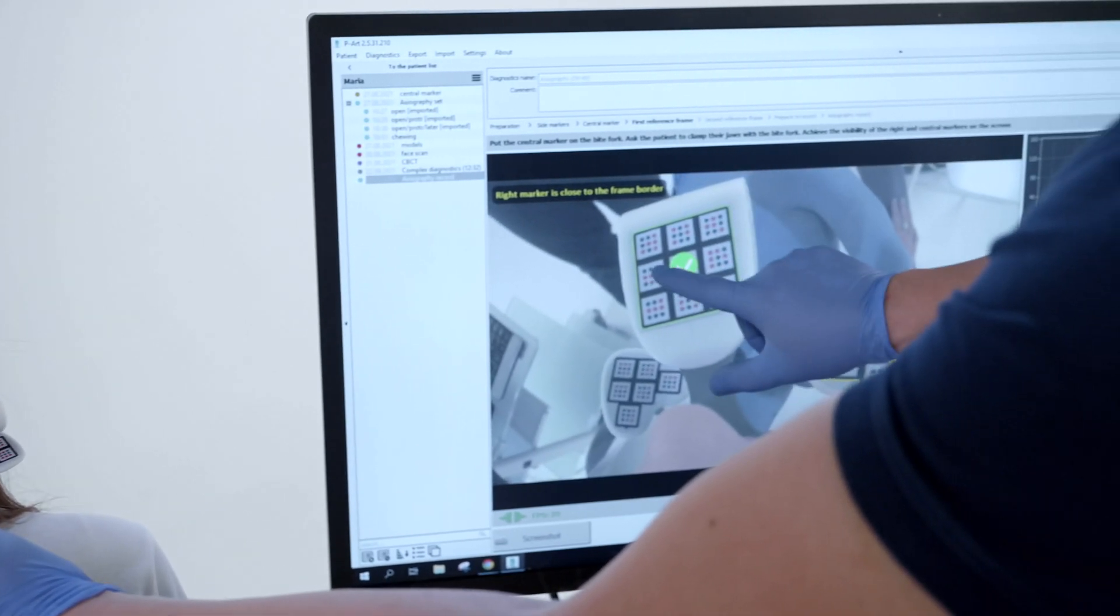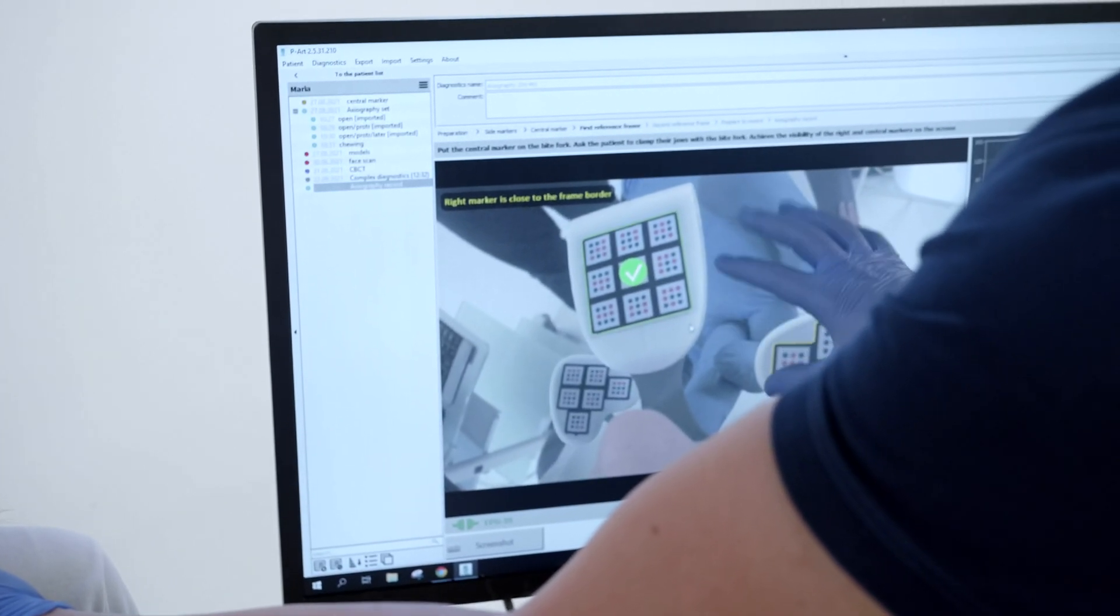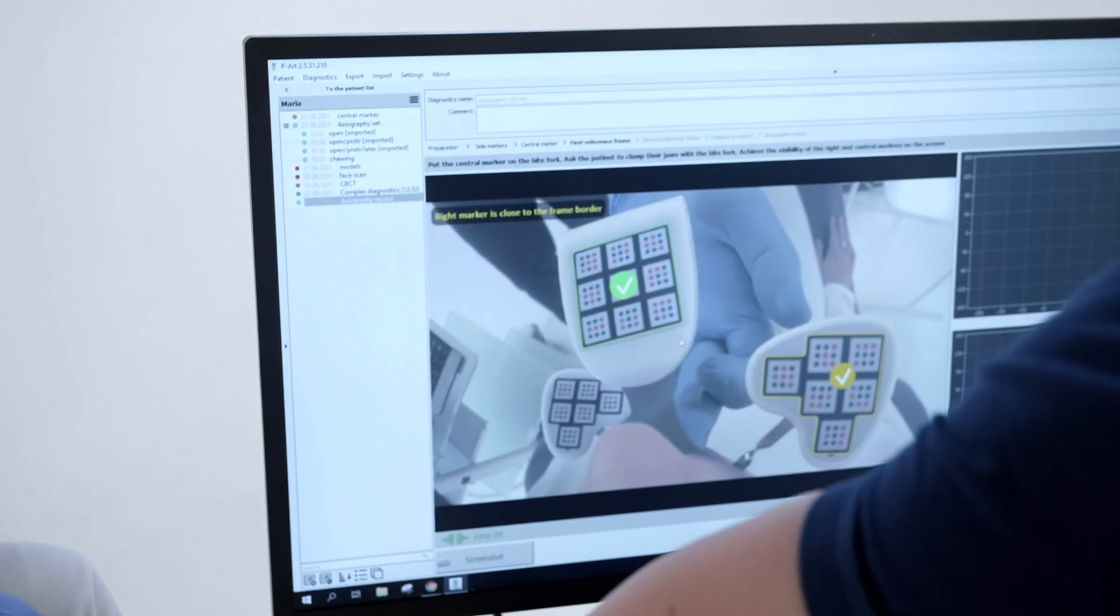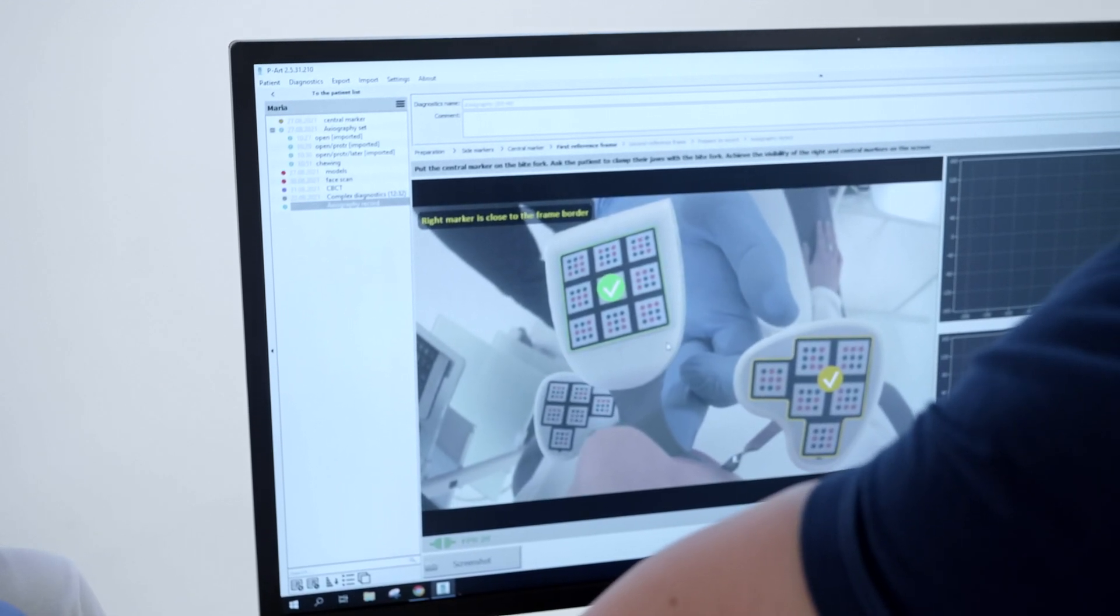If the right marker changes location, then you need to return to the stage of using markers with a digital arc and redefine their location relative to each other.